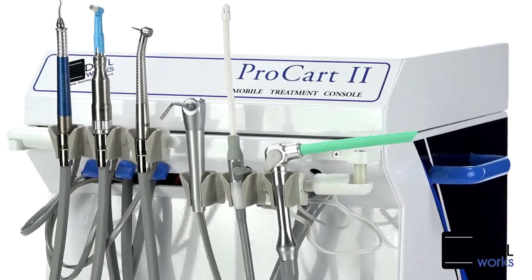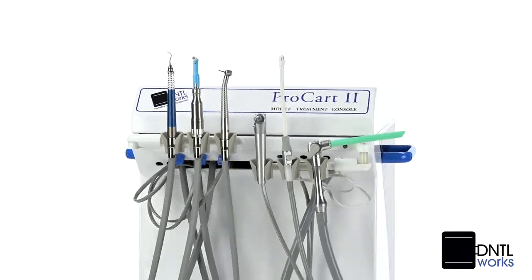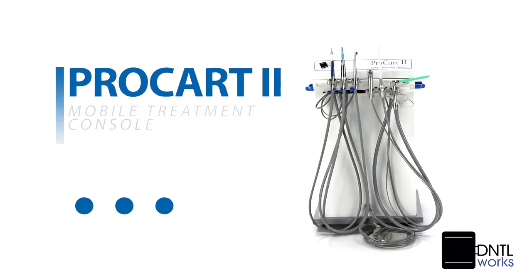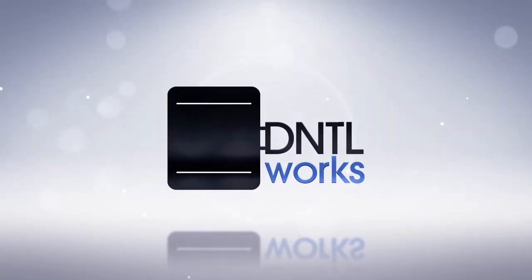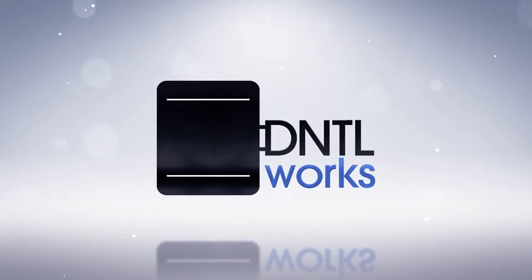Our attention to detail and ability to custom-build quality products provides dental professionals with both economic benefits and a perfect fit to meet their needs.